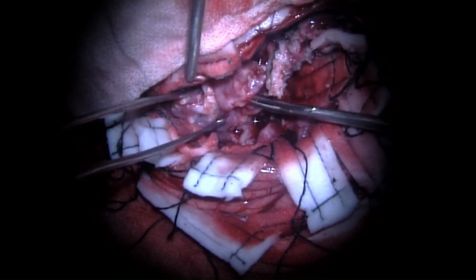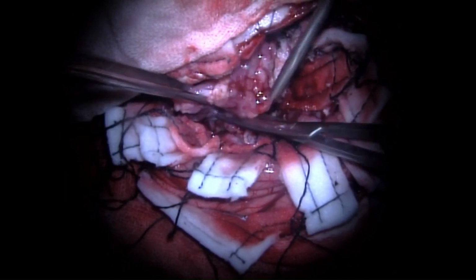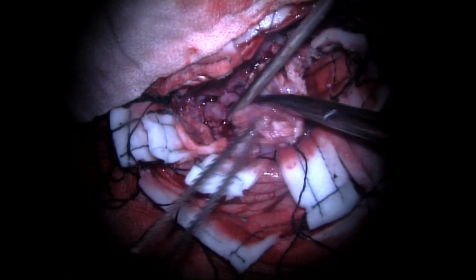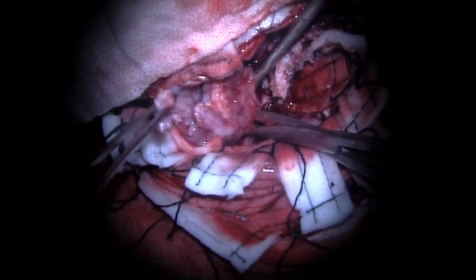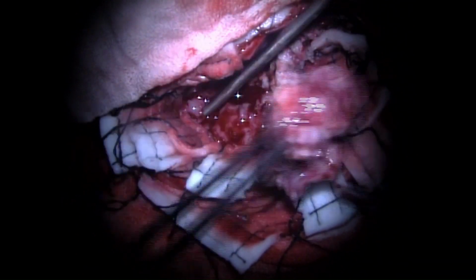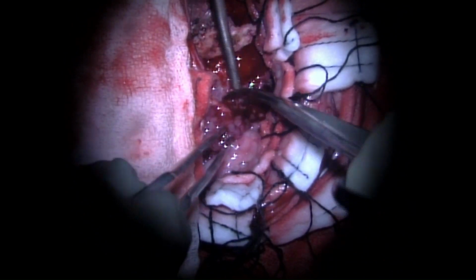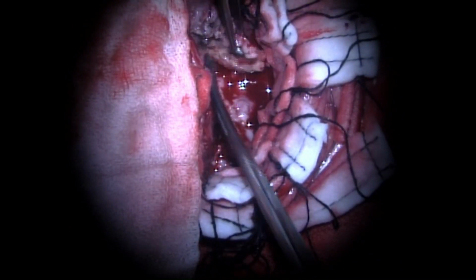It's quite fleshy, if I may say. There were areas within this tumor which were still highly vascular and invited the use of our coagulation device.